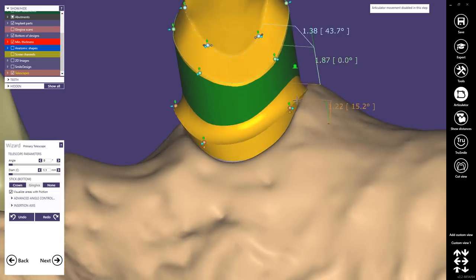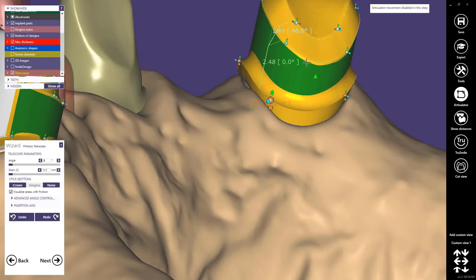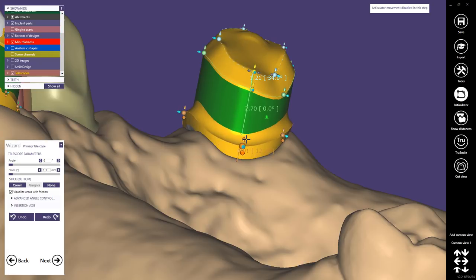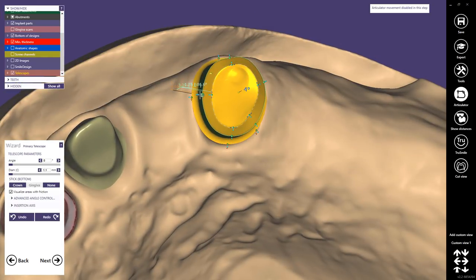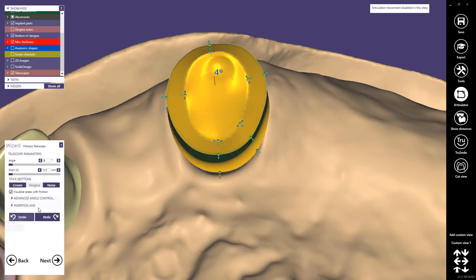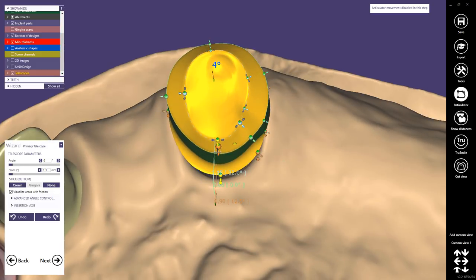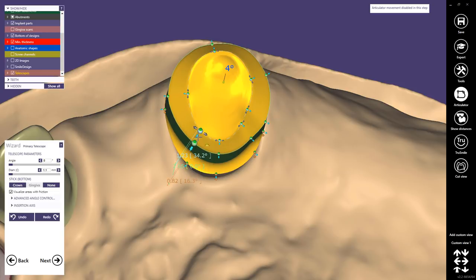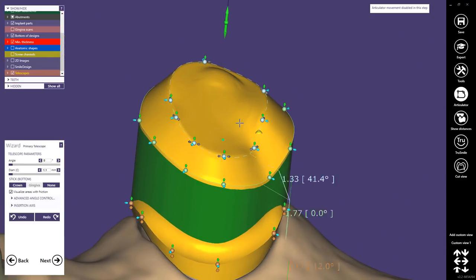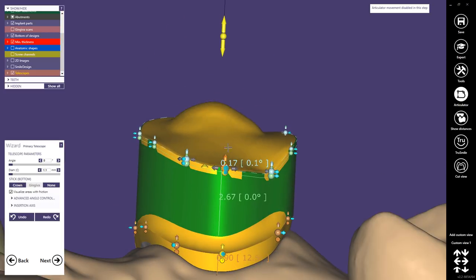Here I will do some individual changes. Okay. Right here, stop for the ceramic. And here, sorry, flat area. Yeah, sometimes you may click on an undesired symbol, so then use the undo button. Control and shift. This again.